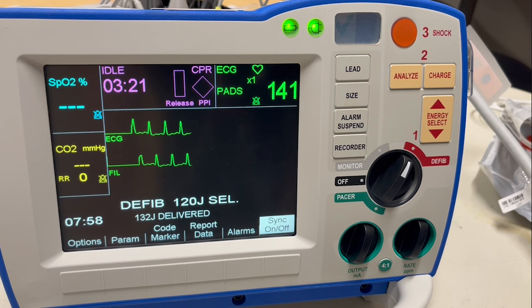This device also comes with AED mode, which can be turned on and off by pressing the Analyze button.